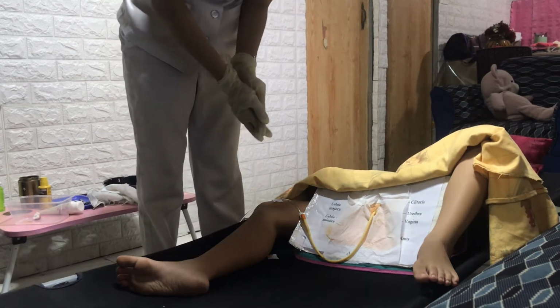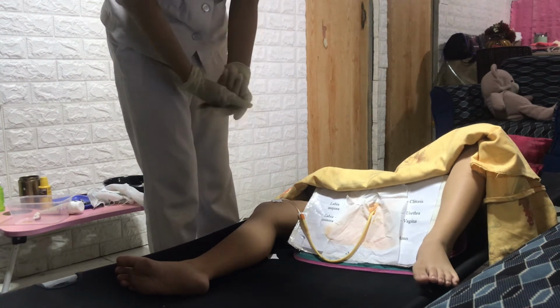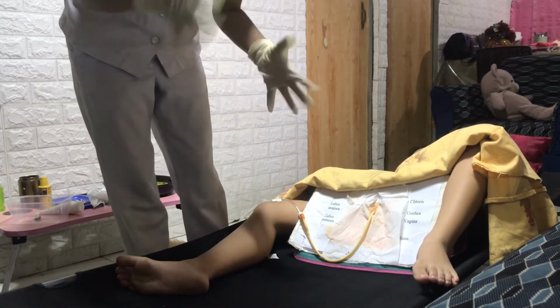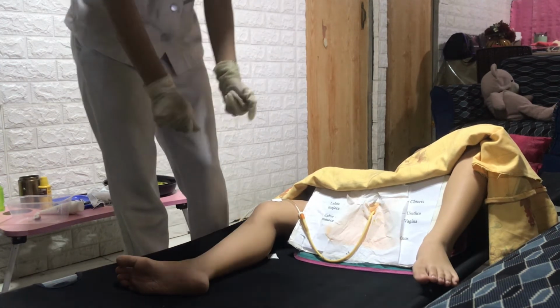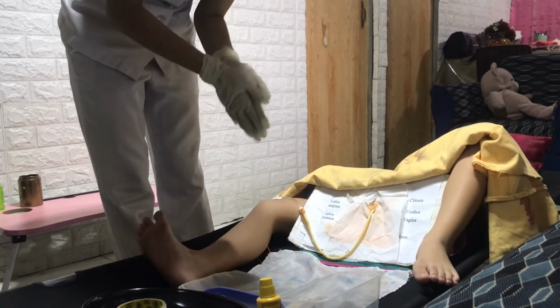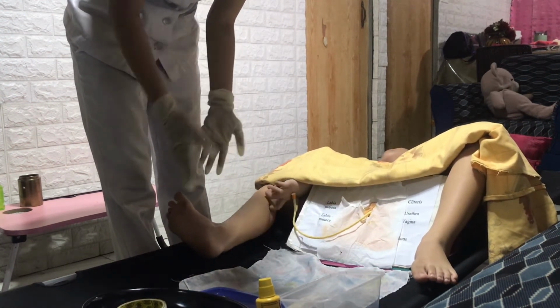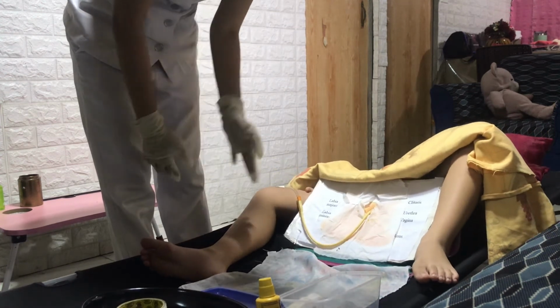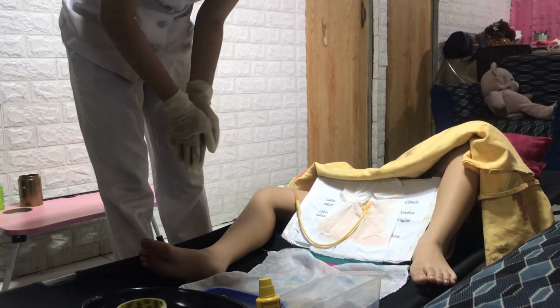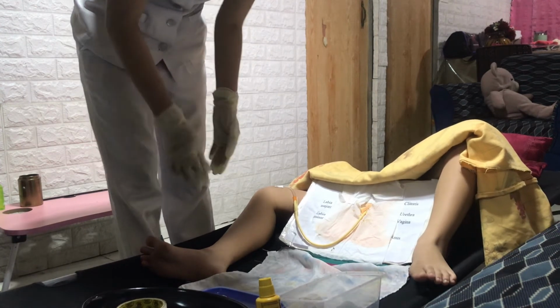We need to assist the client to a comfortable position, to provide comfort and safety. Then do aftercare and replace all the equipment to its proper places. Again, the rationale for this is to prevent contamination.